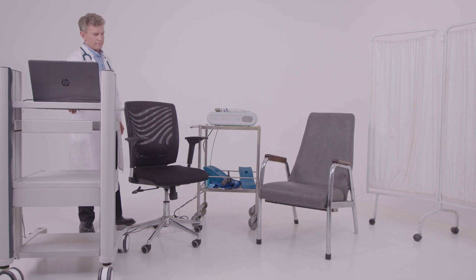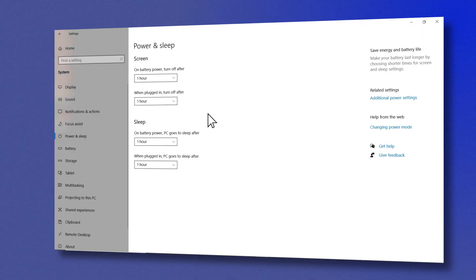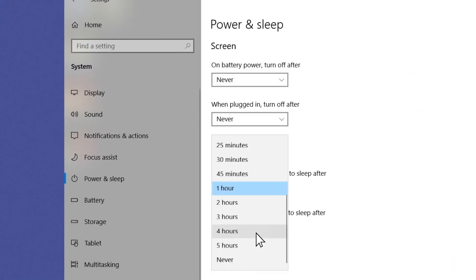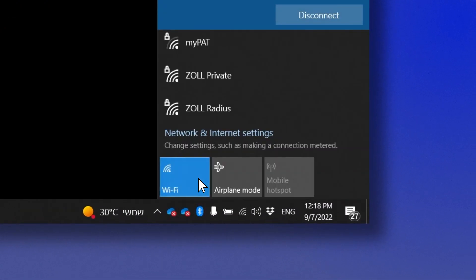It is recommended for the laptop and the device to be on a trolley. Make sure the laptop is connected to a power outlet and that power and sleep settings are set to never. Turn off Wi-Fi and any other application running on the computer and disconnect other devices.